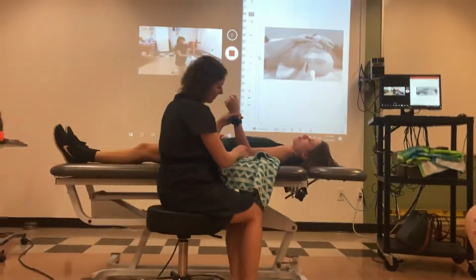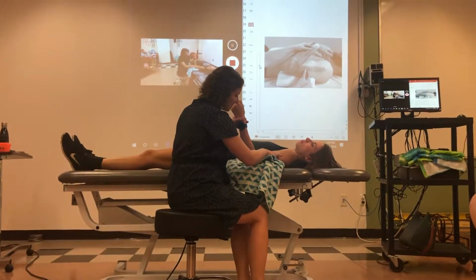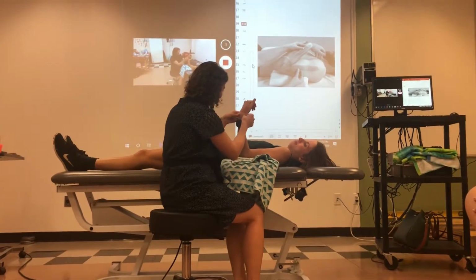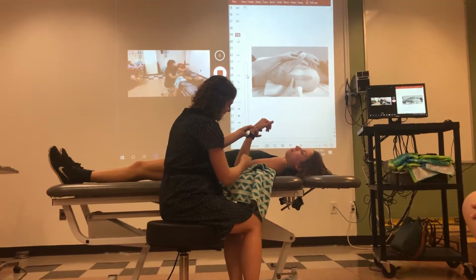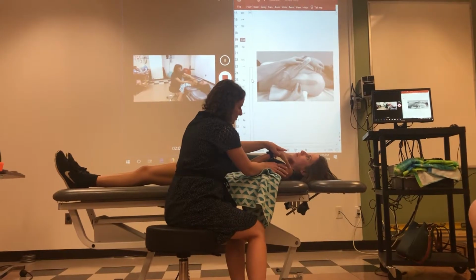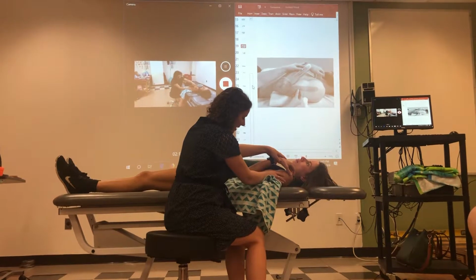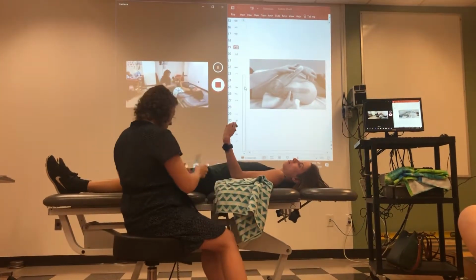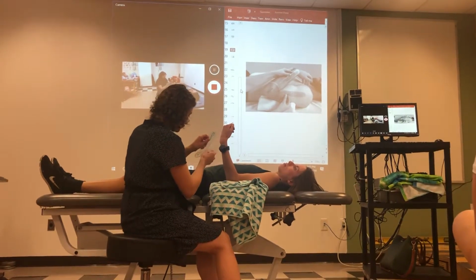Epicondyle. The midline of the humerus is going to be the stable arm. And then you're going to be using the radial styloid process as your bony landmark. Okay. So again, you take her all the way through the range, assess the end feel, and guesstimate about how much her angle is. So I'd say maybe that's about 140, 130. You'd set your goniometer at that range.